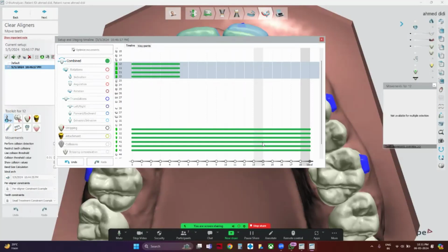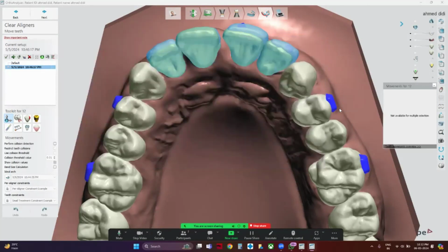So you can ask the patient, okay, you start with the upper, but the patient can continue wearing the upper aligner for a month, something like that. Because there is no point finishing the treatment entirely in the beginning. So you can either tell the patient that you can start wearing the aligners at the third month and wear them for 10 days or something like that. Is the concept clear? That's up to you.